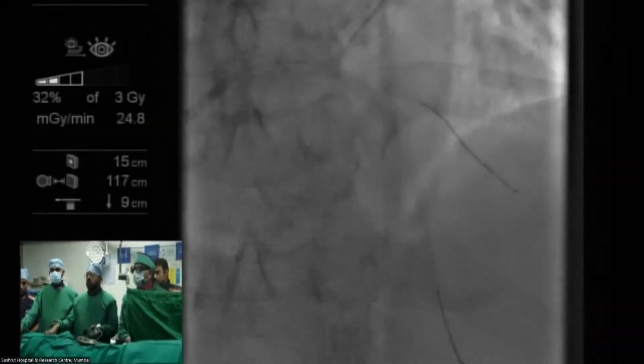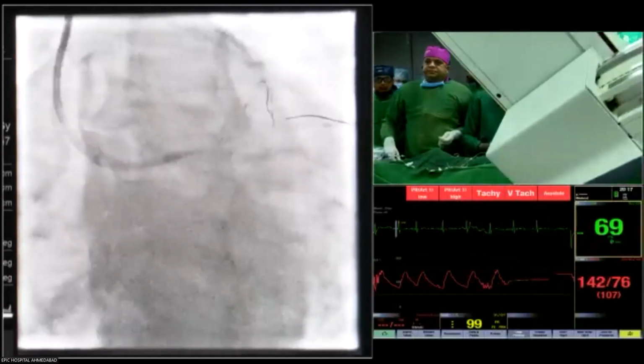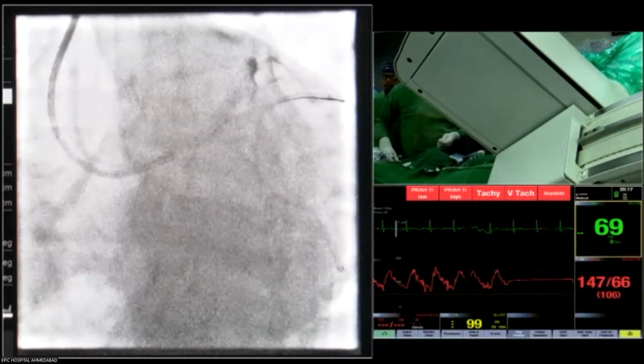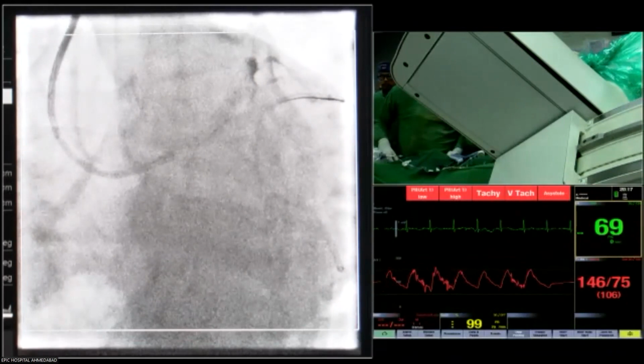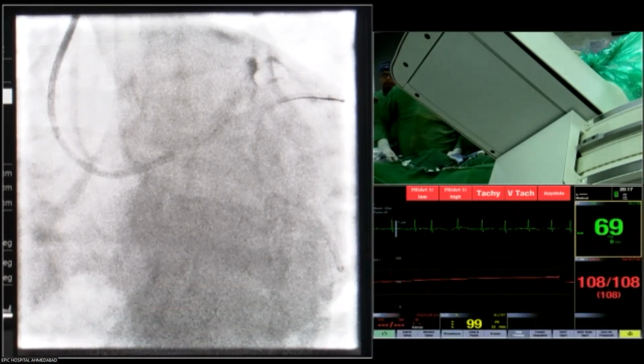Oh, we are with the Joyal and we are back. Can you hear us? Yes, Anup, we can hear you. So the other thing, when we are talking about Ahmedabad, everything is radial. So ours is also 7 French radial only. And we took a 7 French guide.